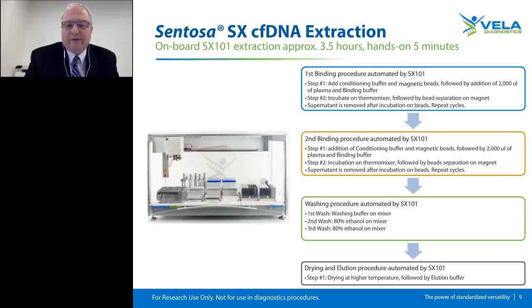Okay, so this procedure takes about 3.5 hours, as I had mentioned earlier, with a hands-on time of loading the robot for about 5 minutes with the desired consumables.